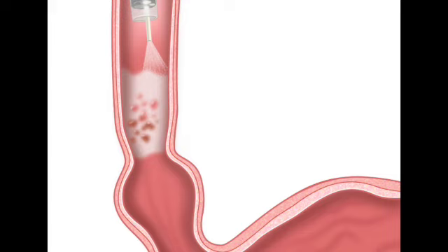It really does. And it leaves me with a thought that is kind of hard to shake. Oh, what's that? We have just explored how a common liquid sitting in your kitchen pantry right now has the power to outsmart some of the most elusive, invisible cellular dangers in the human body. So if a simple splash of vinegar can temporarily pull back the curtain on hidden precancerous cells just by slightly altering how surface proteins reflect light, what other everyday, perfectly ordinary substances might hold the power to expose the hidden biological mysteries inside us if we only knew exactly where and how to apply them?